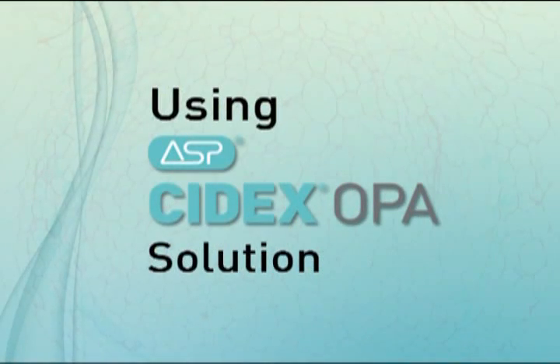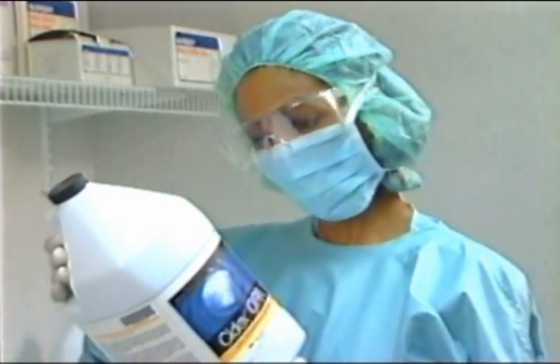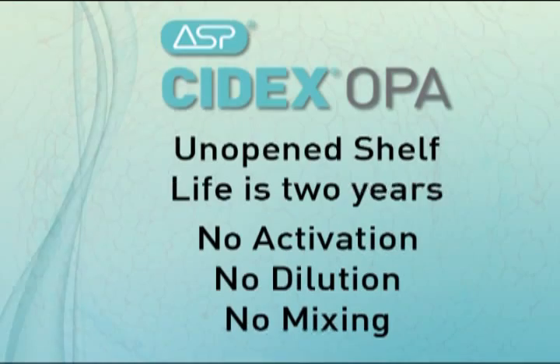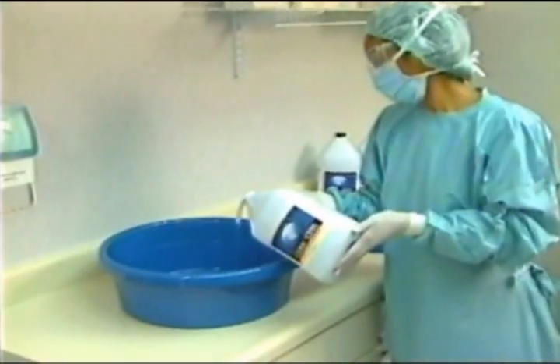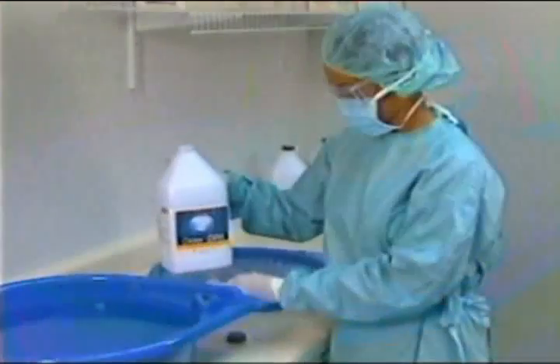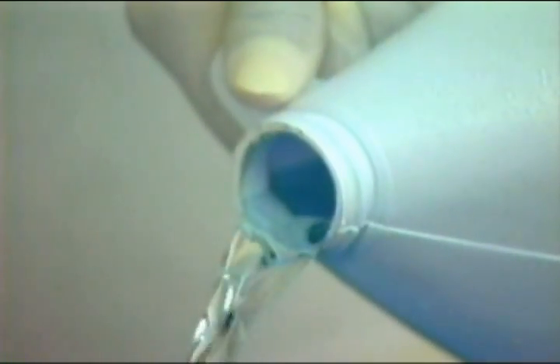Once the instruments are clean, you're ready to begin using Cydex OPA solution. Before using the solution, be sure to read the instructions for use and the bottle label. The shelf life of an unopened bottle of Cydex OPA solution is two years. The solution requires no activation. After opening the bottle, pour the required amount into a Cydex solution tray or appropriate container. If there is still solution left in the bottle, reseal it. The remaining solution can be stored up to 75 days.